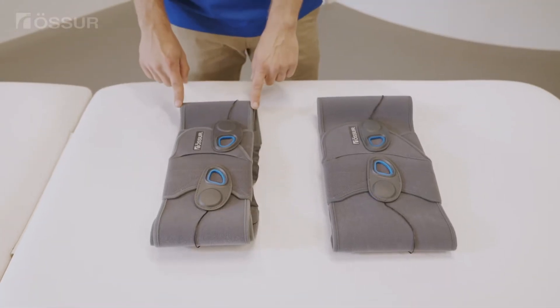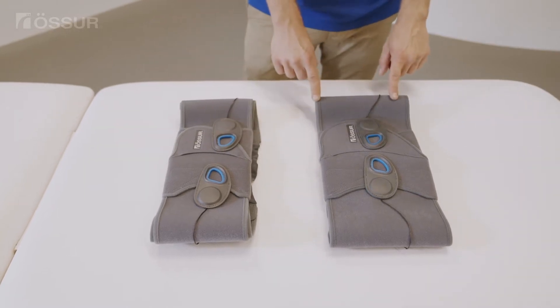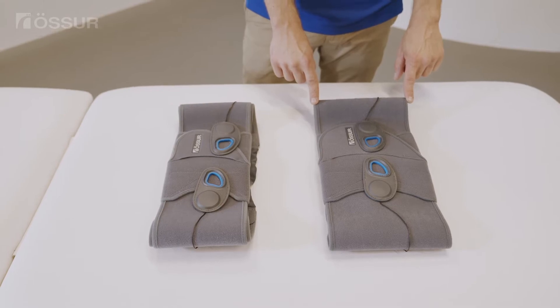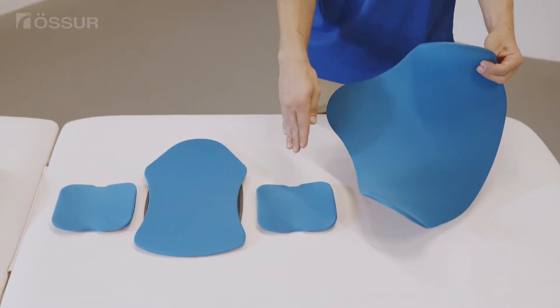The universal belt is available in two belt widths: the 6 inch or 15 centimeter slim version and the 8 inch or 20 centimeter standard version. Both can be used with a variety of different lordotic or non-lordotic back panels.